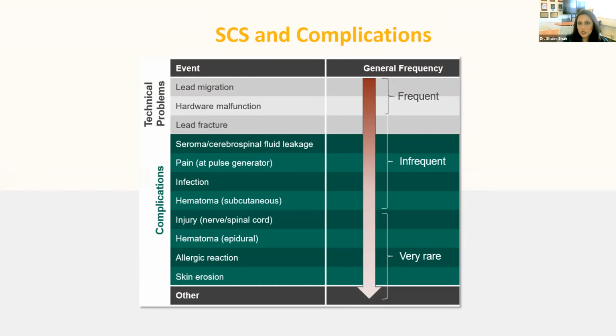It's a same-day surgery, so we bring you into the hospital after the surgery is completed. Once you meet the recovery room criteria, you can go home. We'll send you with the programming and talk to you about how it works.